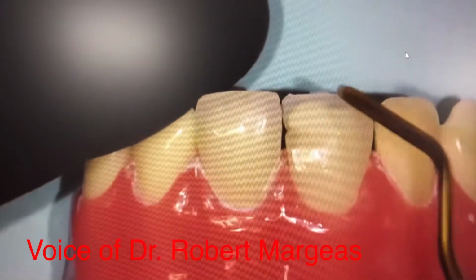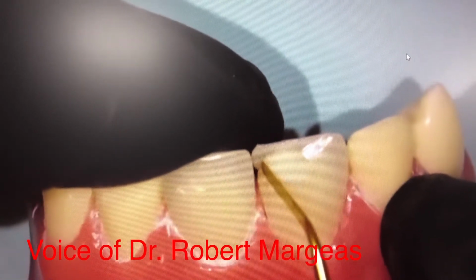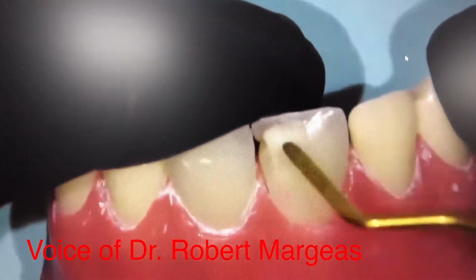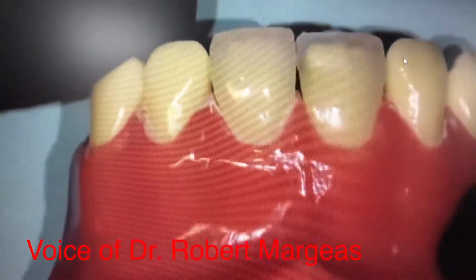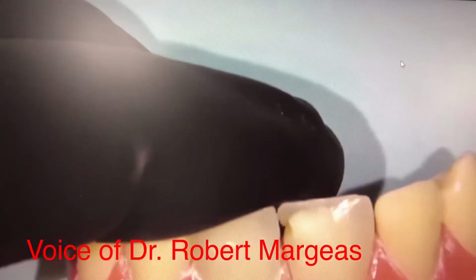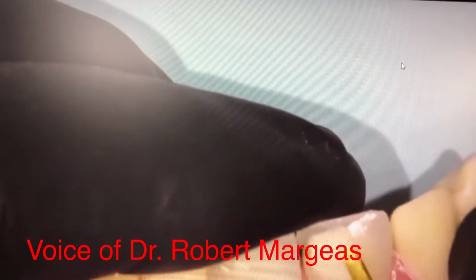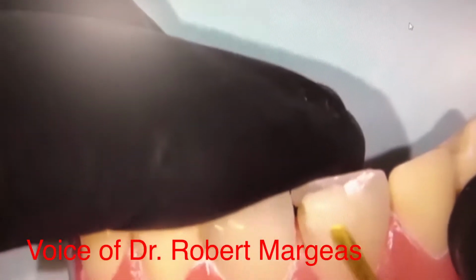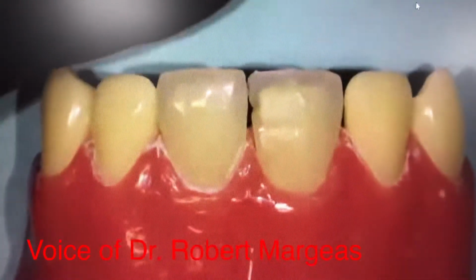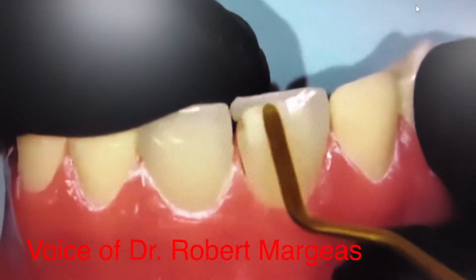So, you see where the dentin is going into the interproximal? I'm going to keep that shy of that interproximal in order to create the effect. And then I've got to create what? Those three little lobes, like the adjacent tooth. You can see on my black background, see those three little lobes, those fingers? I want to try to create that. And what I'm going to do is thin this material out, but I want to block the fracture line. So what am I doing? Smudging it out, blending that in, and I'm going to continue to make my little lobes.